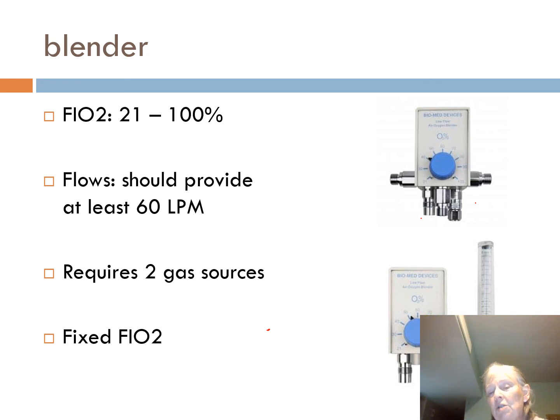The reason we do that is that if I'm delivering 40% oxygen out of here and I set my large volume nebulizer at 40%, I'm now blending 40% with whatever's coming from the outside, and my patient's no longer getting 40%. So they're going to get 40 out of here, goes through that large volume nebulizer that's set at 100%, and the patient, in fact, is getting 40%.